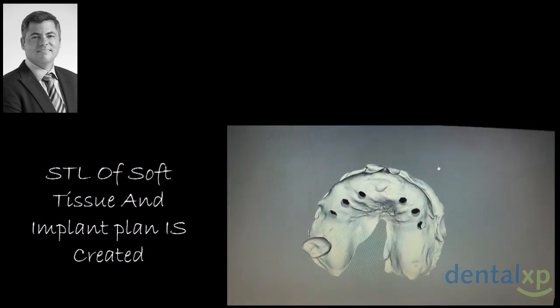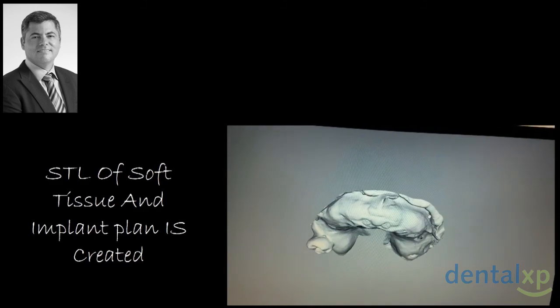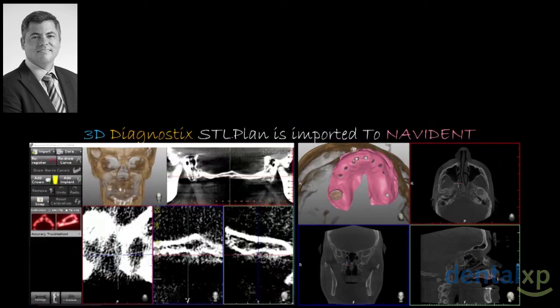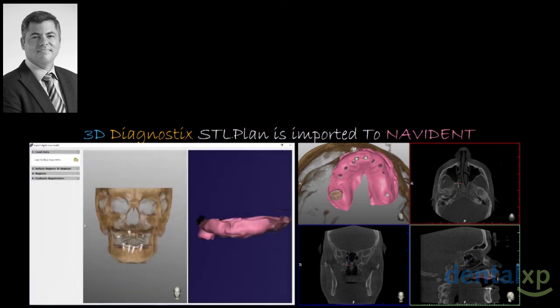Now, this is an STL of the original plan that we had done with the interactive software. It's exported into Navident because Navident can accept optical scans, and that's one of my big inspirations.